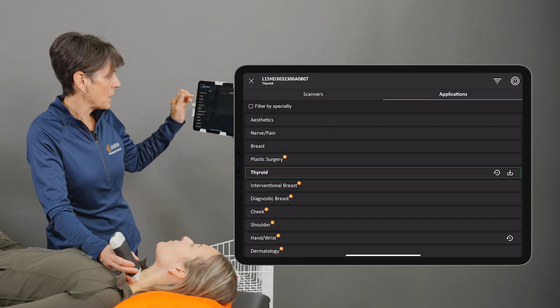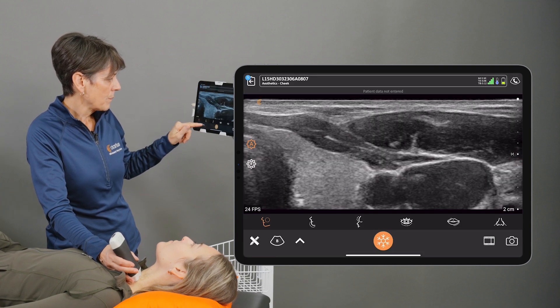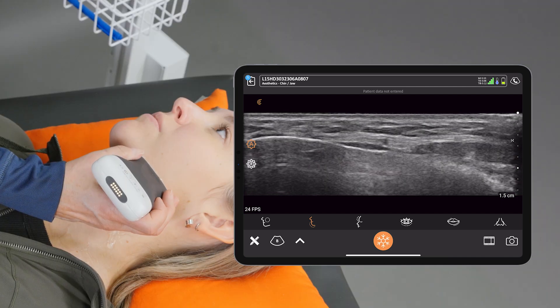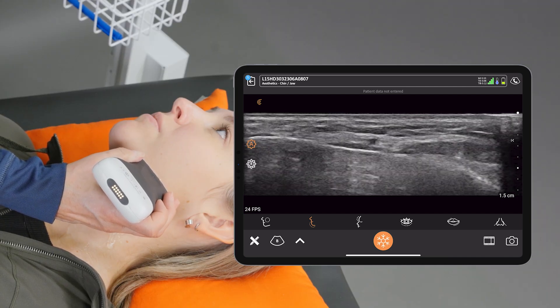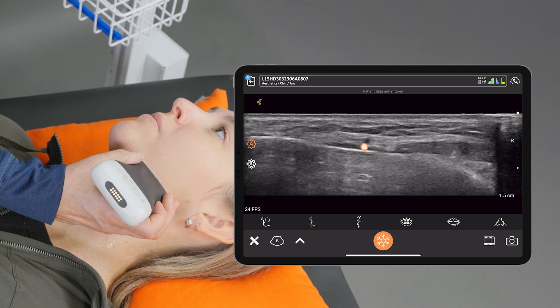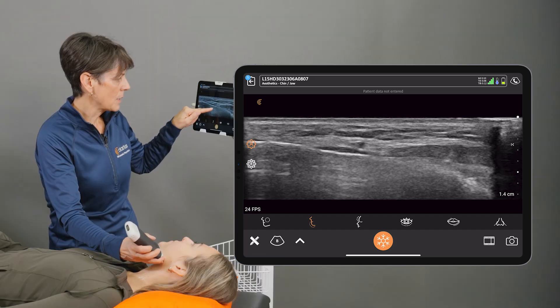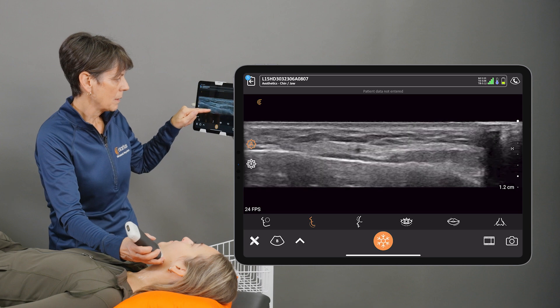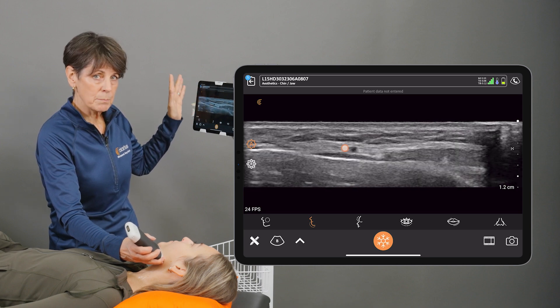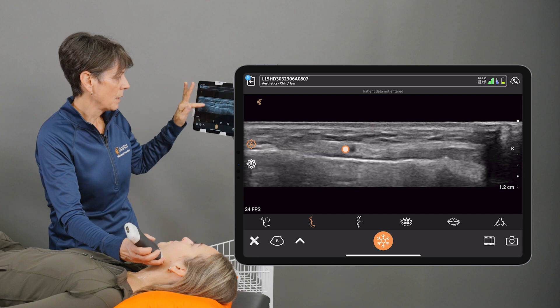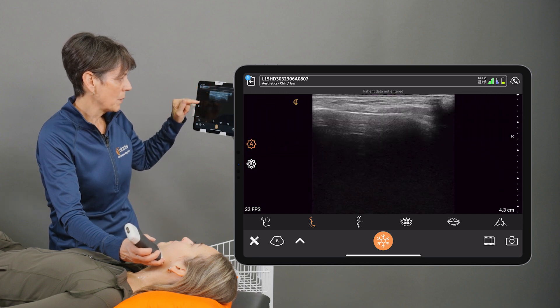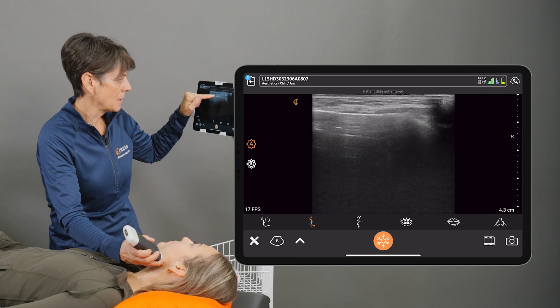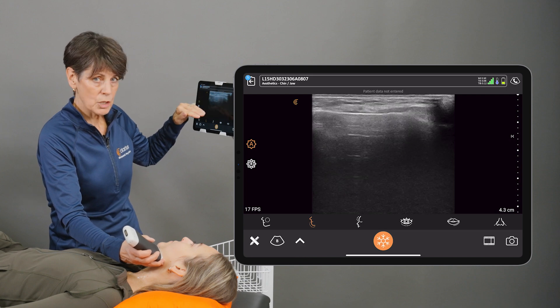Now if I go into a facial aesthetics preset and look at the chin, I can look for the facial artery. I can see it in the middle of my screen but it's pretty tiny, so let's center that by decreasing my depth — now I can see that vessel in the center of the image. If my depth was too deep, I can hardly see anything except a tiny black dot, the jawbone, and a shadow behind it.